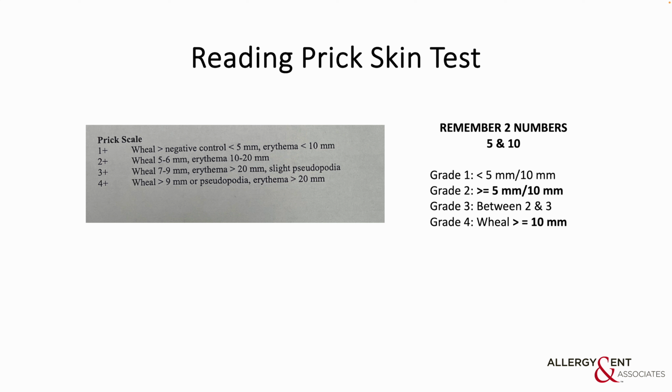But even when you get used to it, you may move so quickly when you're in a hurry, and there's a chance you may write down or transfer the result to the computer wrongly, and that will be really, really bad because all the results will be wrong. Therefore, I stress the importance of being attentive and extremely careful when you read and transfer the test result. Okay, so I would like to show you a simple way to read the skin test.